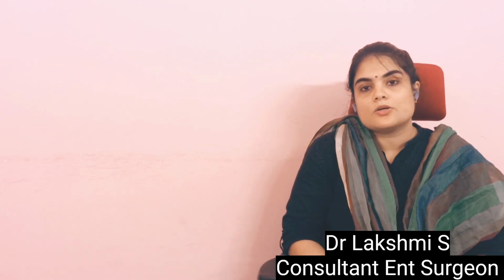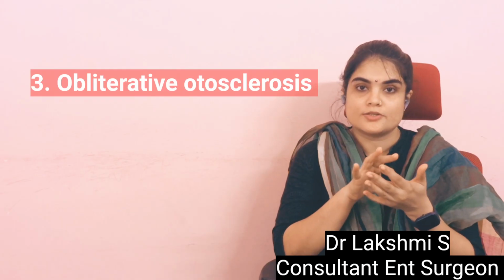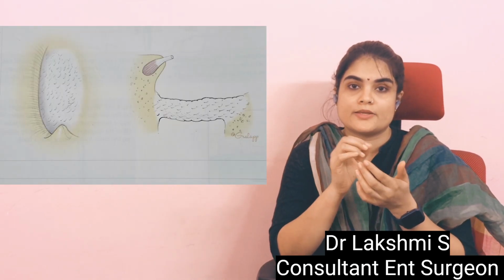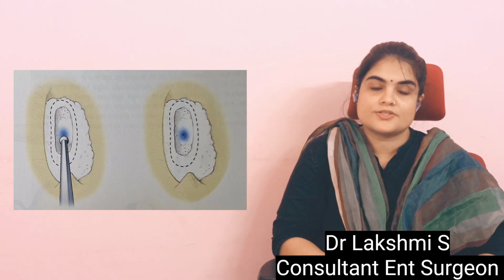Another problem that can be encountered is an obliterative otosclerosis. The bone is so thick that you cannot use a laser to pierce it. So you have to use a drill and make the bone thin until a blue layer is seen, and then you can do a fenestration surgery.